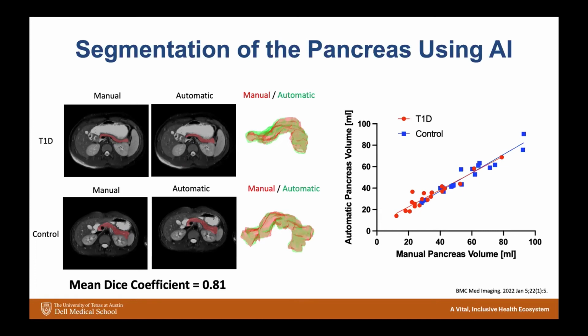And one of the things that I've found is that if I really zoom in and look at the pancreas, sometimes the automatic segmentation almost looks better than the manual segmentation, right? So our human reader is limited by how closely she can go around and accurately define those very small changes in image contrast. Our machine learning algorithm, I think at times, is actually outperforming our gold standard. So it's interesting to think of ways to accurately quantify those differences.